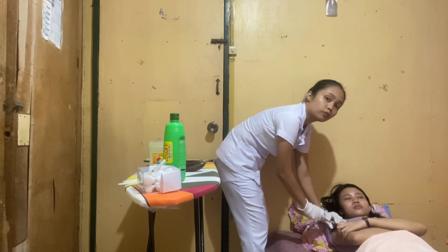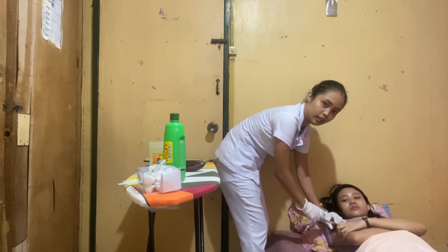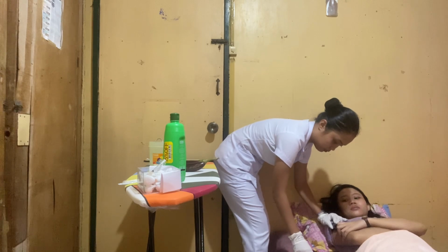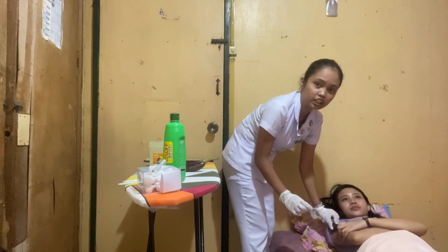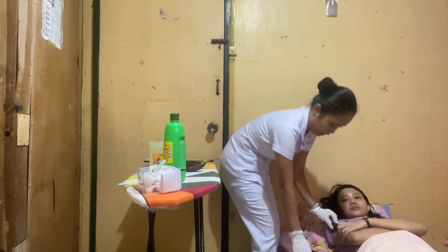Now, we're going to remove the needle from the patient's body at the same angle it was inserted and then apply pressure to the injection site. And discard the syringe into a waste receptacle to avoid needle prick injury.